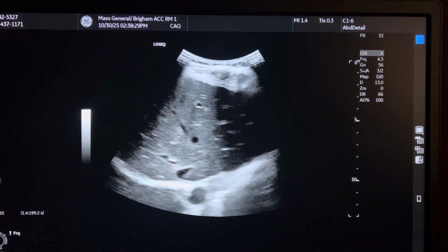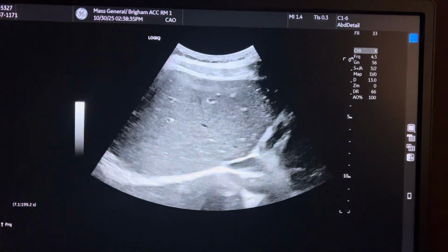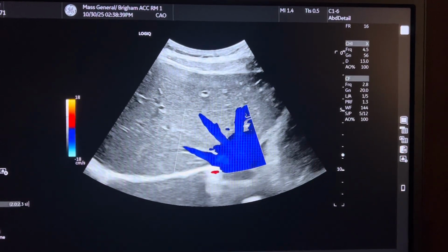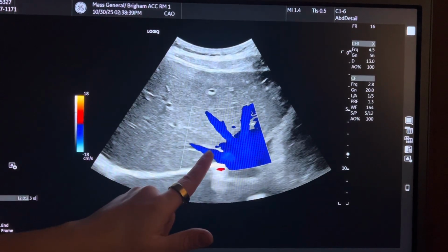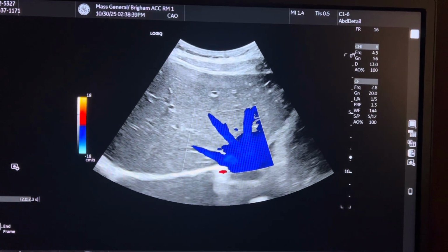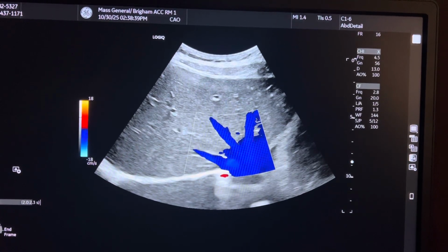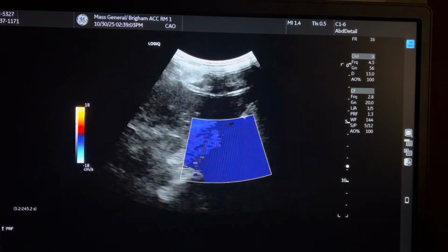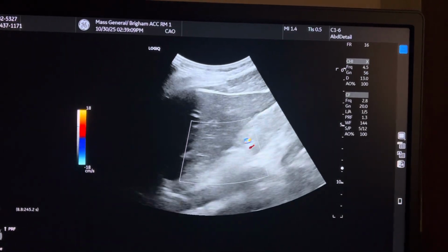Now, some people go subcostal on their patients. Big breath in. Some people go subcostal, so underneath the ribs, and you can see all 3 hepatic veins diving in right here. Breathe. Beautiful picture, right? But you're kind of far away from these vessels, and the left one can be a little bit tricky to find here as well. Although with a picture perfect patient, it's going to be easy. With those more difficult, kind of fluffier patients, liver disease, all of those factors, it's going to be a little bit more difficult. So I like to get my left hepatic vein in sag left lobe.